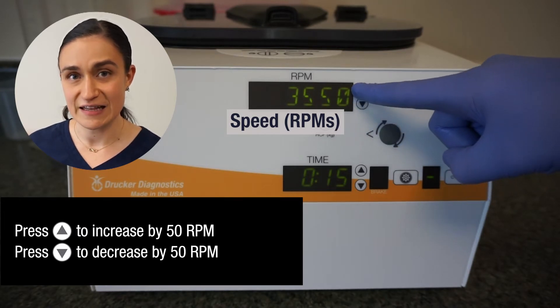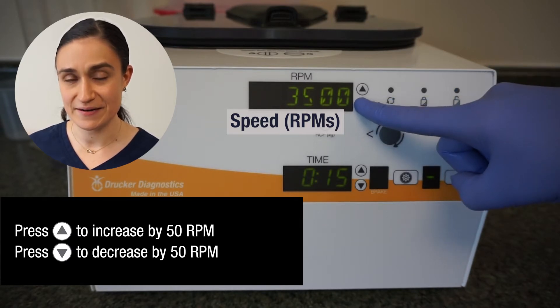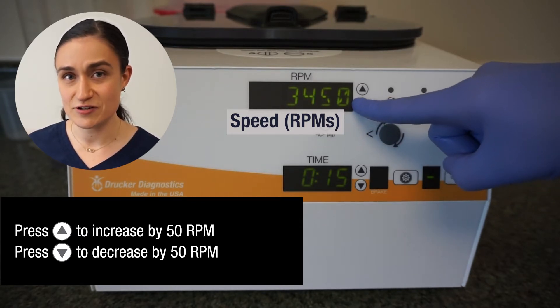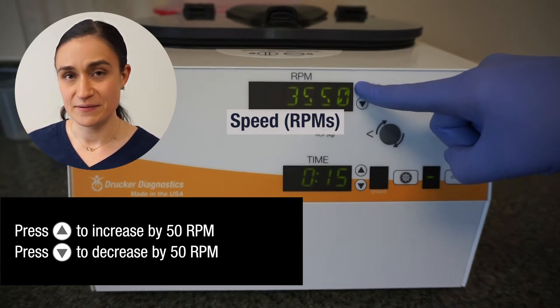If I accidentally overshoot, I can use the down arrow to get back to my desired speed. Same thing if I accidentally drop it down too far — I can use the up arrow to return to where I want to be.